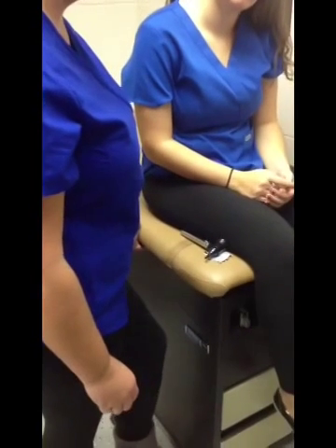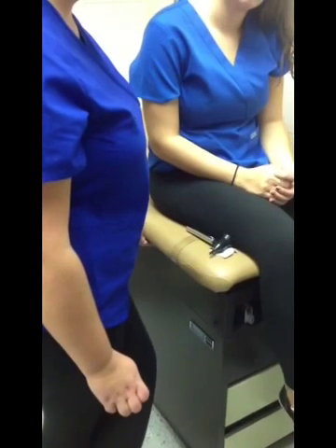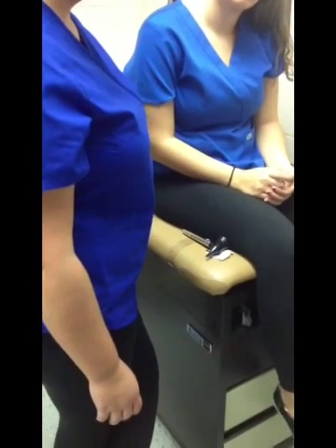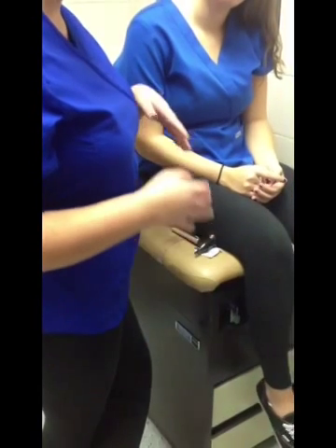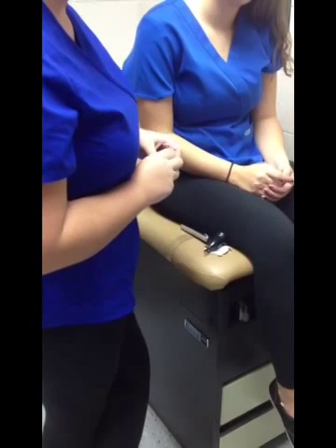Your otoscope may be able to puff a small amount of air into the canal to see how much your eardrum moves with the pressure. This is known as insufflation. Normal air pressure of the middle ear should equal out to the outer ear. It allows your eardrum to respond to the sound of vibration.